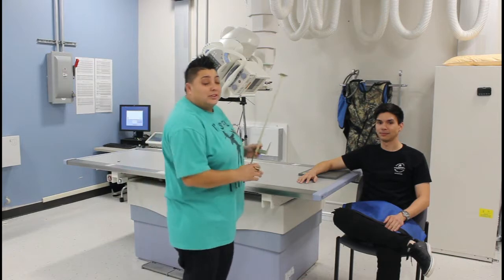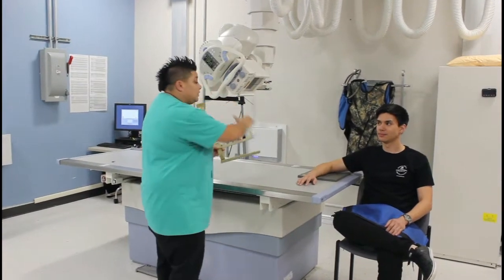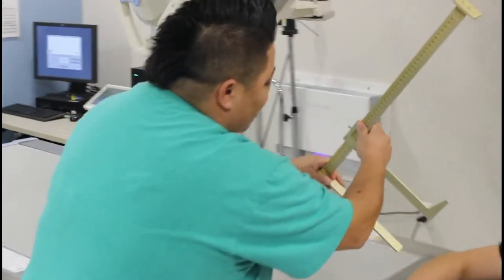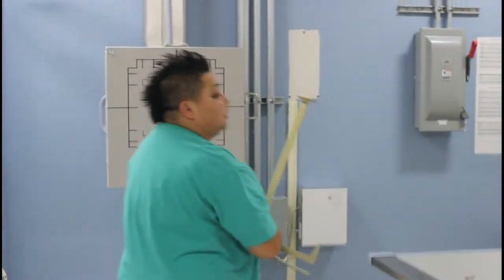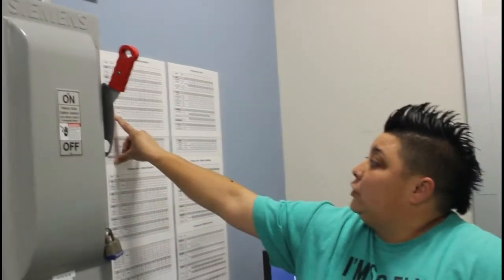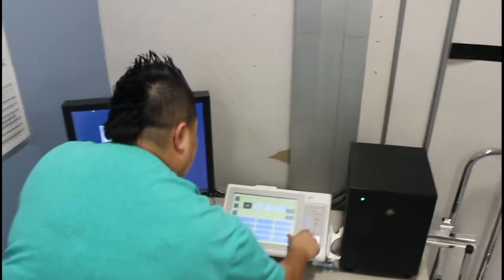Alright, and now we are going to demonstrate how to find the technical factors in this room. Since the tube is all set up at the correct angle, you're going to take your calipers and measure where the beam is going through, which is going to be the oblique angle. So we're looking at a 12. Once we get that, we go ahead and go over to the chart and we look for the elbow oblique. So we have 70 for the kVp. Scroll over to 12 and we have 2.2 for the mAs. We're going to come down here and input that.